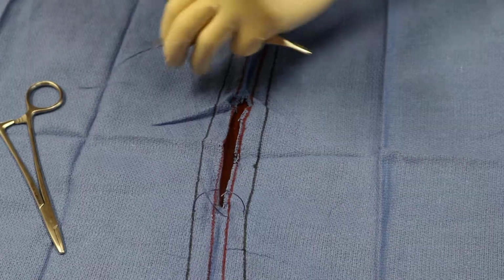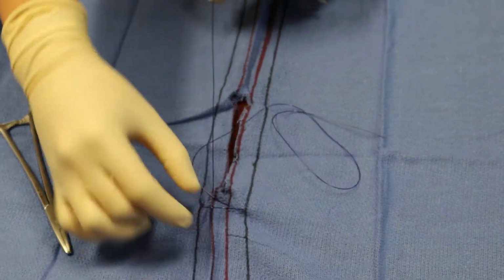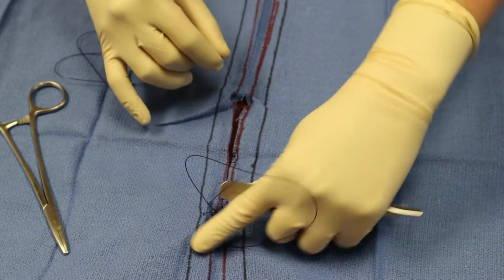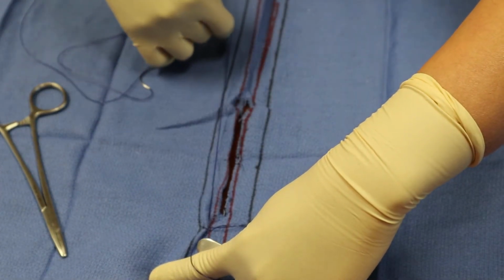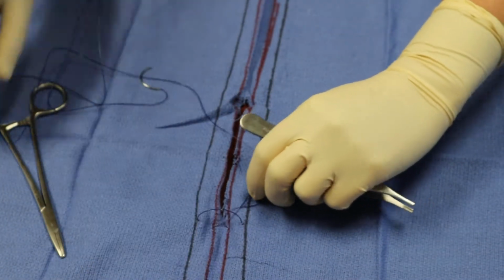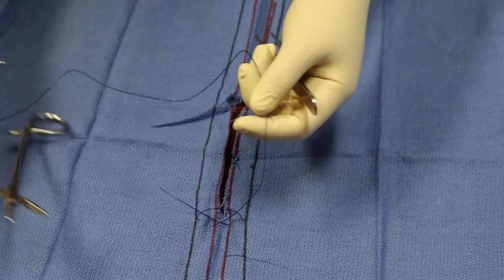And another thing to think about when you're practicing at home is since you're going past the incision site, there's no pocket for this knot to drop down into. So you need to take a little bit of a wider bite than maybe what you think you need so that you create a deep pocket. So I'll take a wider bite when I'm beginning and then ending compared to the ones in the middle, because the ones in the middle have an incision with them.